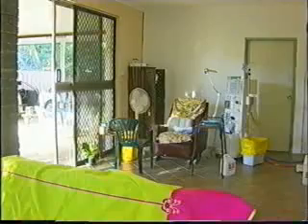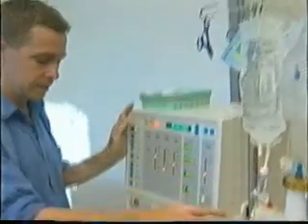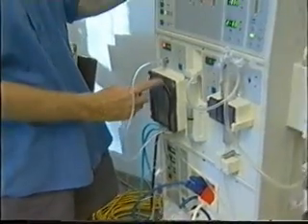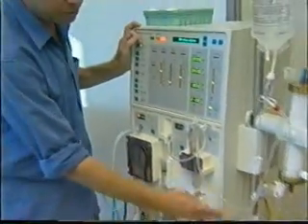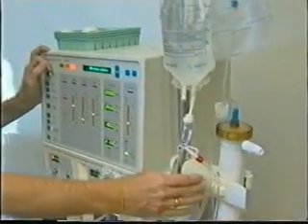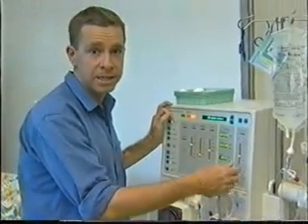Let's go back to Mr. Harding. Basically, I've got some saline here. It pushes fluid through the pump. It goes up through some traps into the kidney, and comes back through the lines and eventually comes back into me.